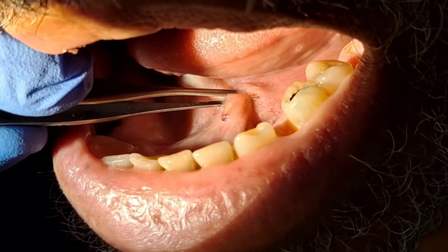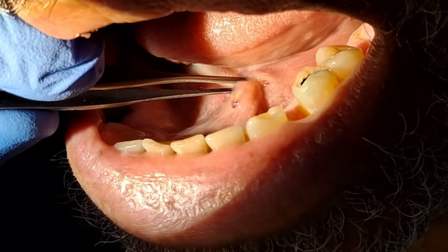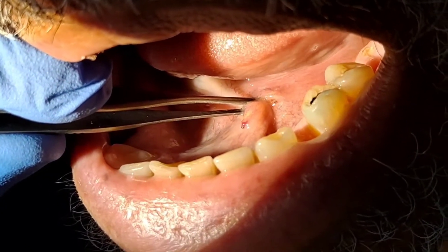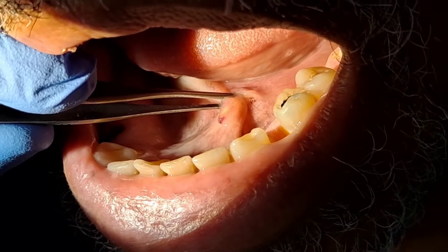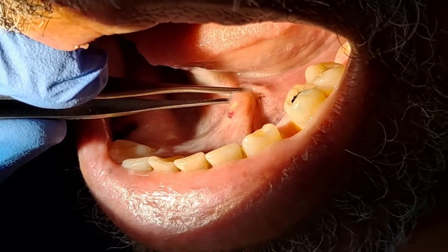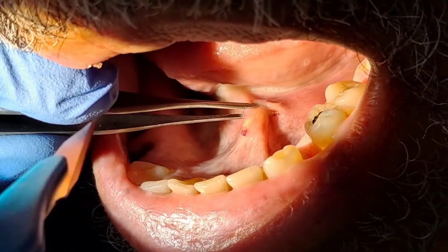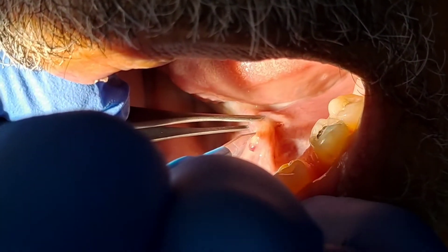It is to be noted the patient was anesthetized prior to doing this using lidocaine with epinephrine. Here we're looking for the 11-blade to make our cut right over the sub-mandibular duct, over the stone, in order to remove it.